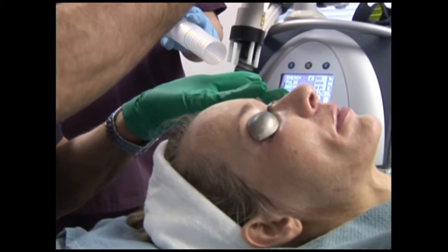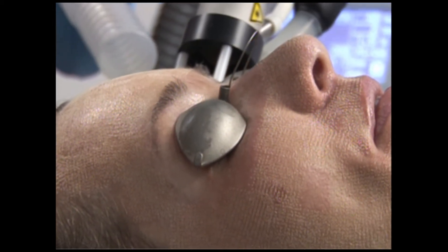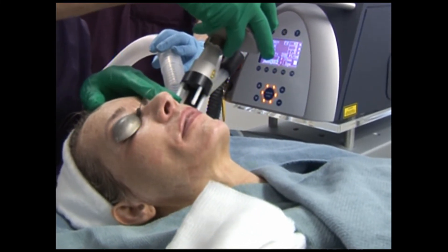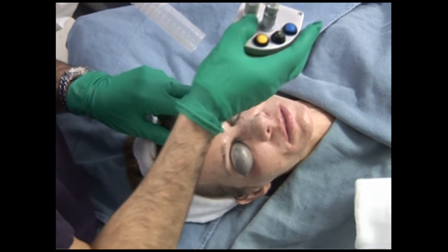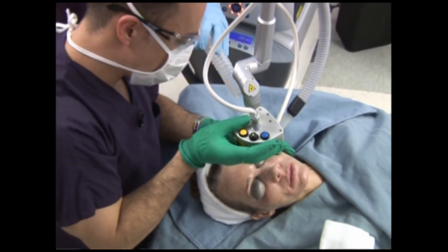This tube has refrigerated air blowing a pretty good blast of cold air on the face, and that helps keep it comfortable so we can keep doing everything we need to do. Come by your cheek.